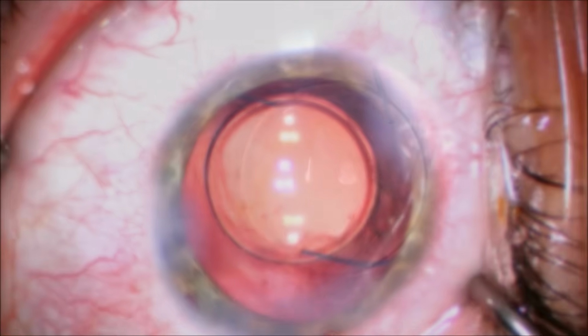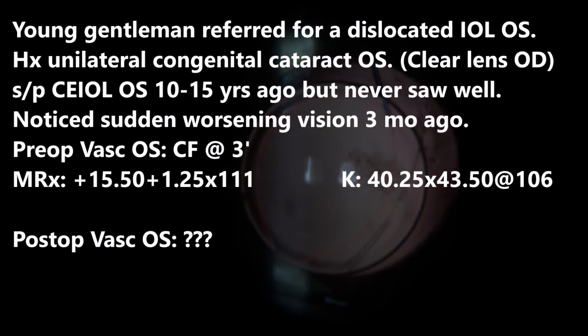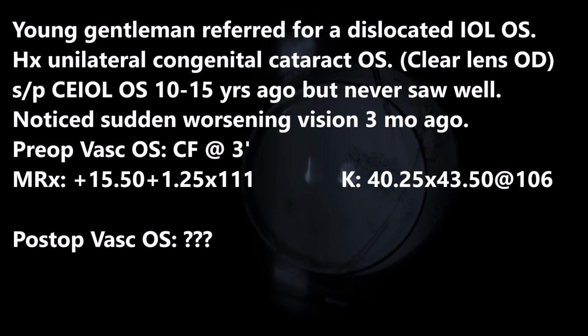But this is a patient postoperatively. You can see the lens is nice and centered, and you can see the capsulorhexis edge right here. The patient has a nice, well-centered lens, again, with a posterior capsulorhexis fixating this through an optic capture configuration. So again, this is a young gentleman with a dislocated IOL of the left eye, had a unilateral congenital cataract in that eye, presumably with some amblyopia, had cataract surgery 10 to 15 years ago, sudden loss of vision with a dislocated lens with the haptic hooking the pupillary edge.